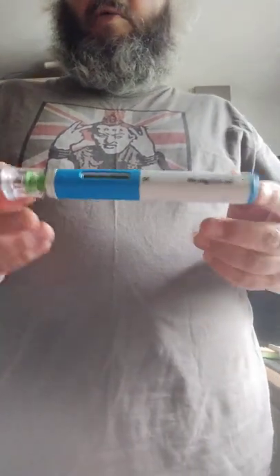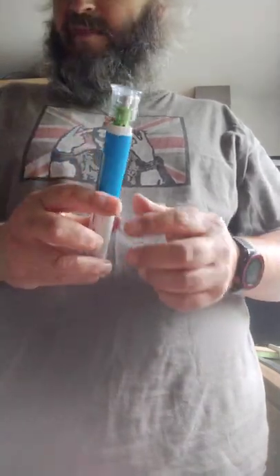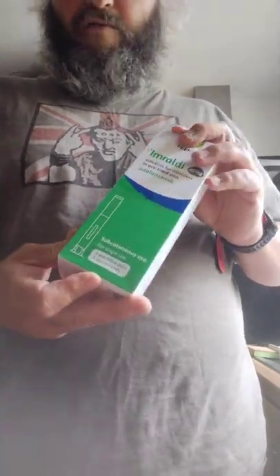With the alcohol wipe — so there we are, it's really quite simple. With your kit you will have a sharps bin, which you dispose of in a safe manner. The other injection stays in the box and goes back into the fridge.